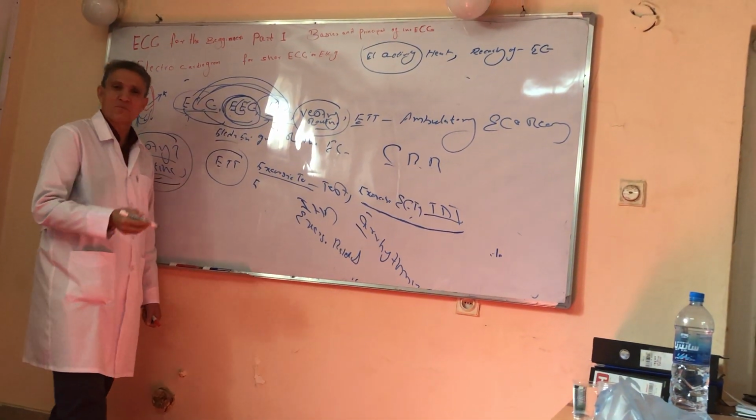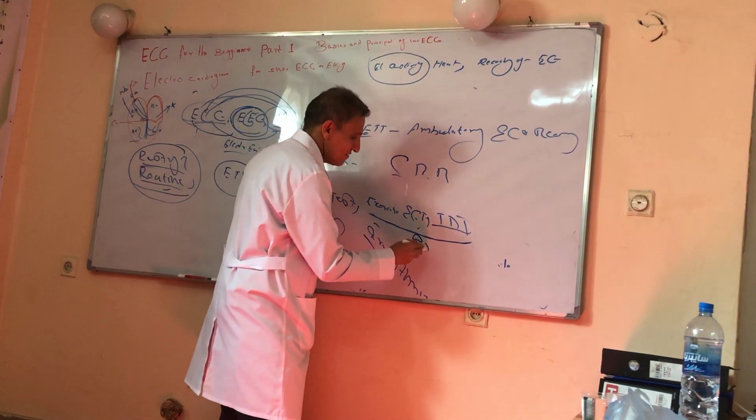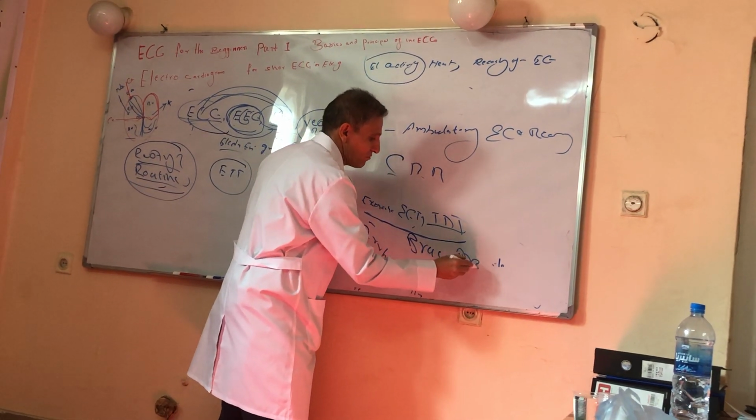This test is performed based on the Bruce protocol.